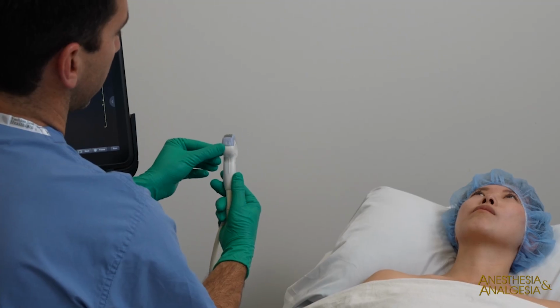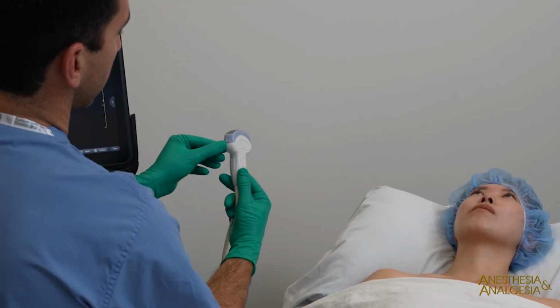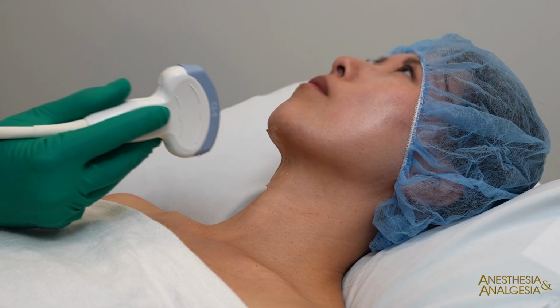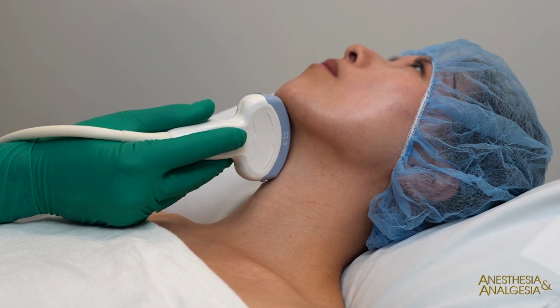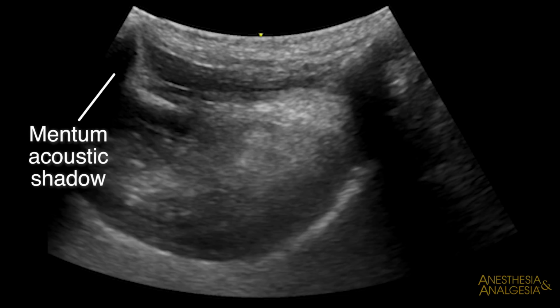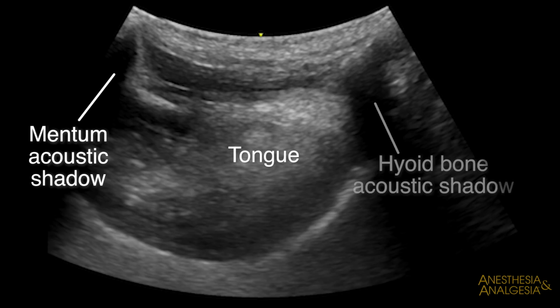The structures of the submandibular space can also be visualized in the sagittal plane with a low-frequency curvilinear probe. Evaluate the submandibular space by holding the probe with the indicator facing cephalad. Visualize the acoustic shadow from the mentum, the intrinsic and extrinsic muscles of the tongue, and the acoustic shadow from the hyoid bone.